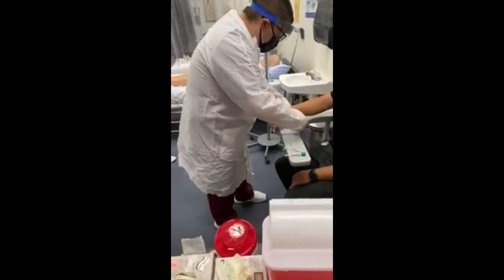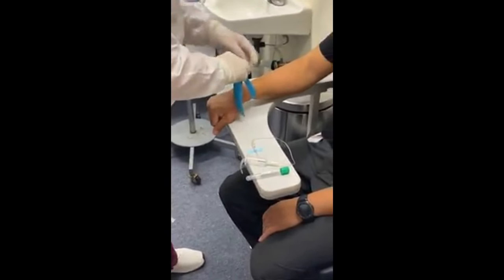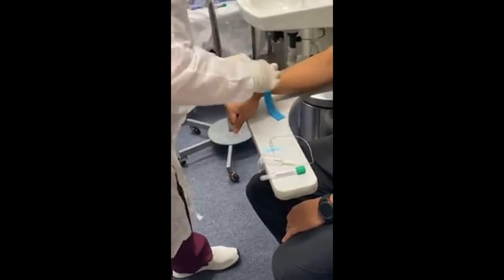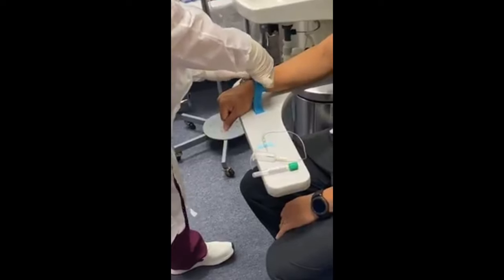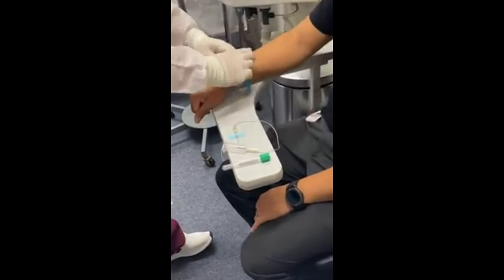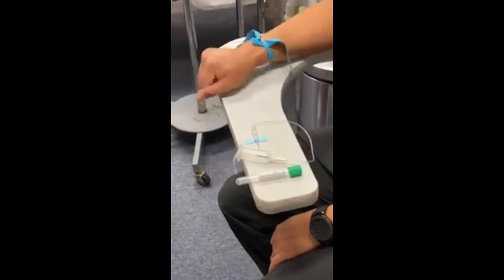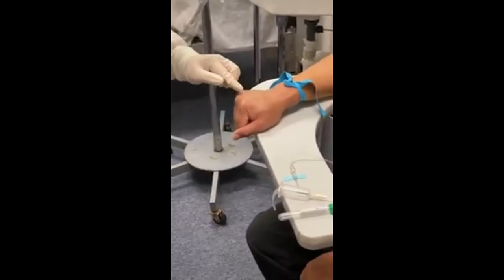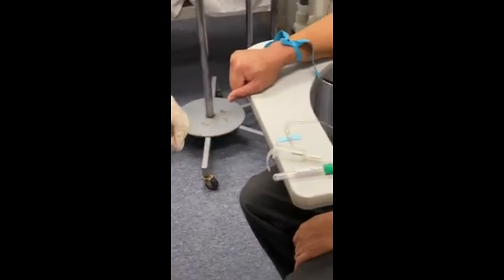Okay. Let me apply your tourniquet again. Let me know if it's tight. If it's too tight, I'm doing my job. Alright. Okay. Perfect. Is it good? Yep. Can you make a fist for me? Okay. Want to verify? Fine. Okay, all right, sir.